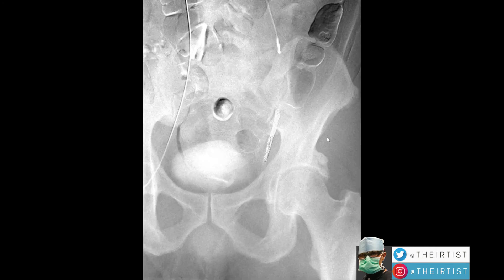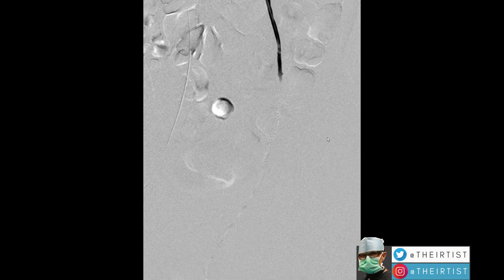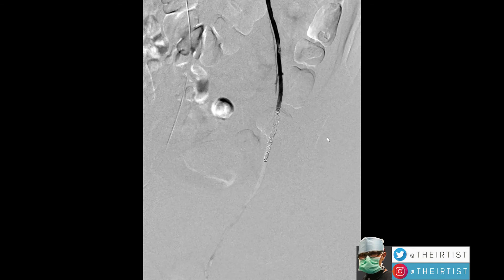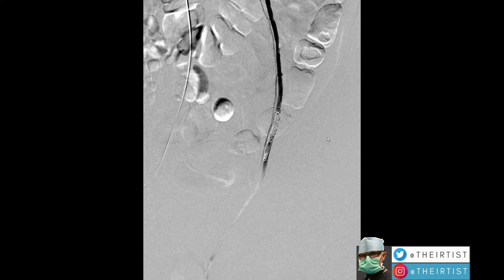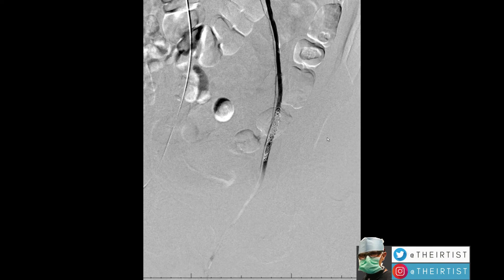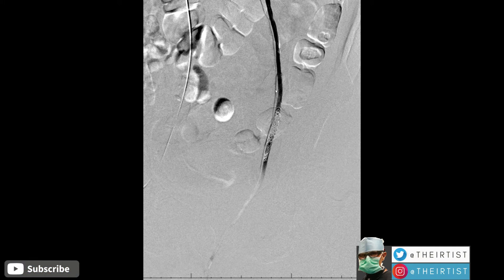If there is a need to place more coils, we can always do so. After the embolization is done, we see some flow into a small vein. If it's a healthy vein, it's fine — we can leave it.